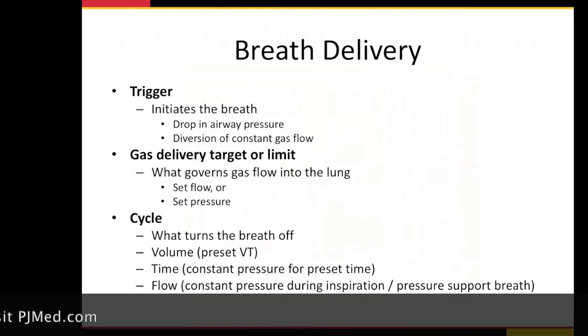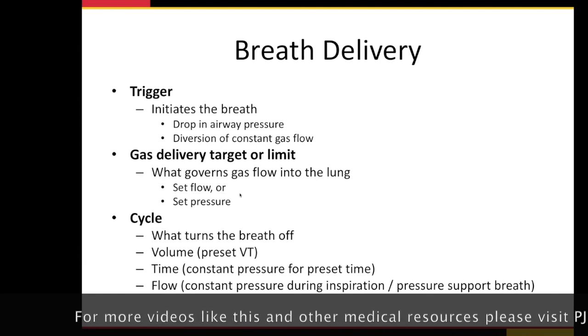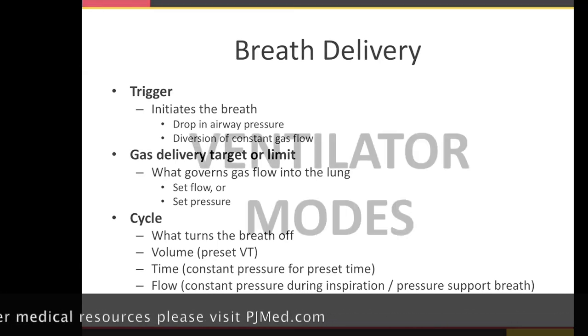And then the cycling is what turns that breath off and lets the lungs exhale passively, okay? Gas delivery, we'll talk about. This is what governs the gas flow. It's the flow of the gas, the oxygen, air mixture you're gonna have, pressure. We'll talk about that. Let's get right into four modes.